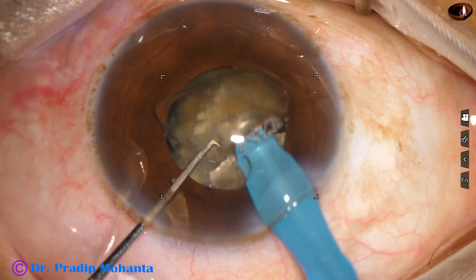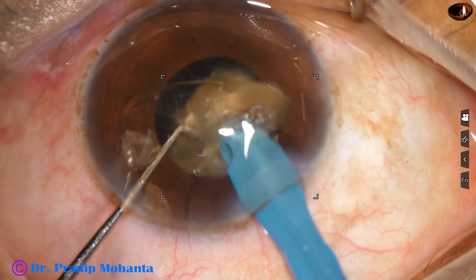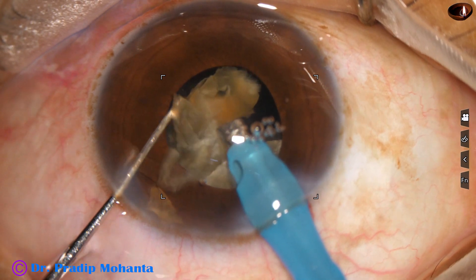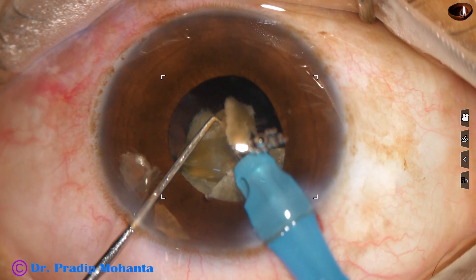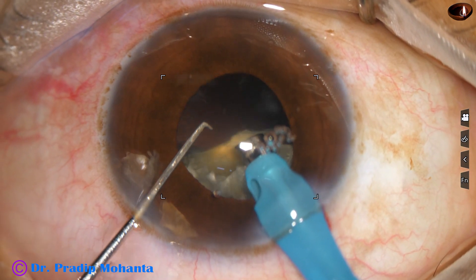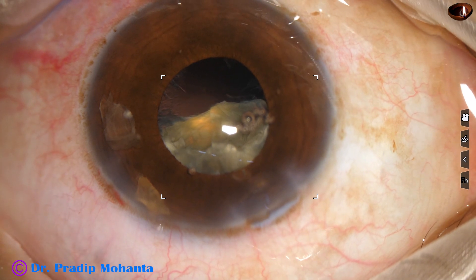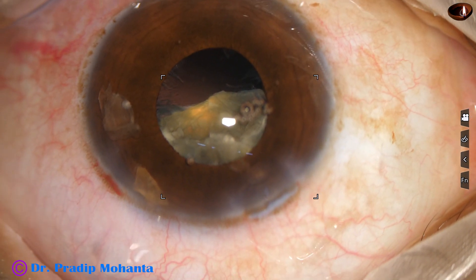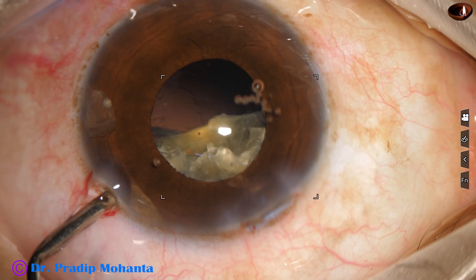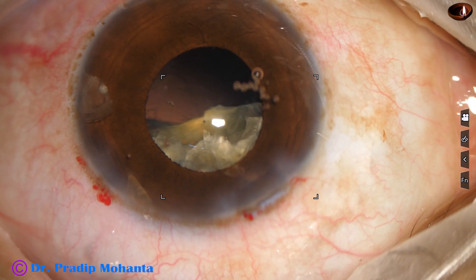I am very careful not to touch the border of the pupil, not to catch hold of the iris tissue, keeping the tip at the center of the pupil always. At this time, I come out — the cataract is hard — and the visco is hydroxypropylmethylcellulose; we need to apply it in such cases twice.